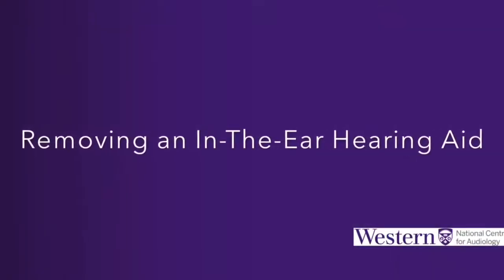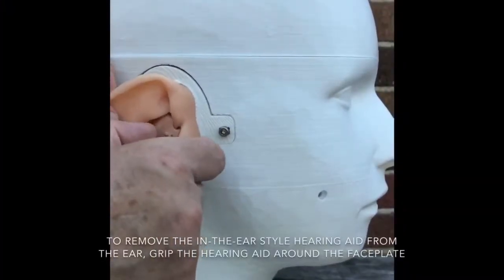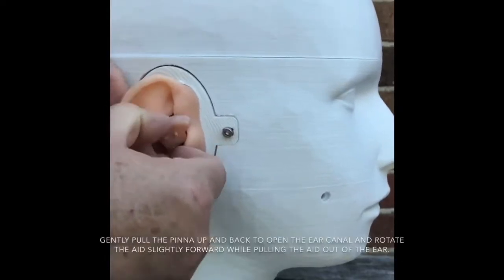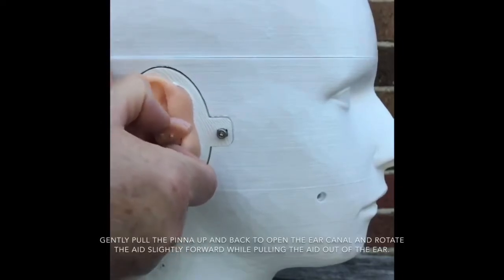Removing an in-the-ear hearing aid. To remove the in-the-ear style hearing aid from the ear, grip the hearing aid around the faceplate. Gently pull the pinna up and back to open the ear canal, and rotate the aid slightly forward while pulling the aid out of the ear.